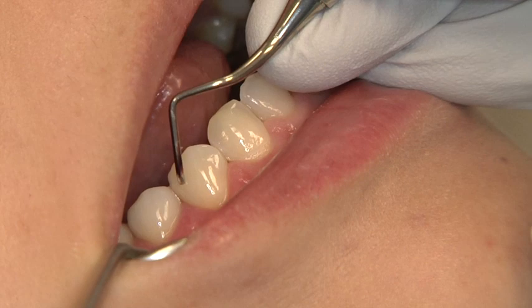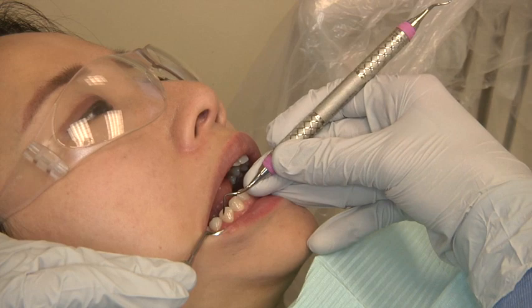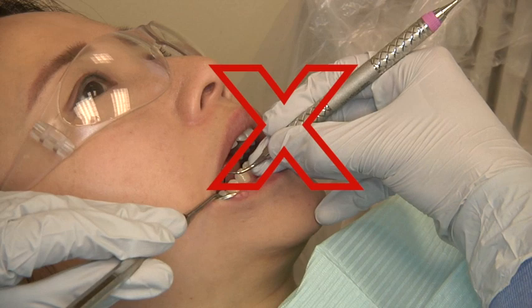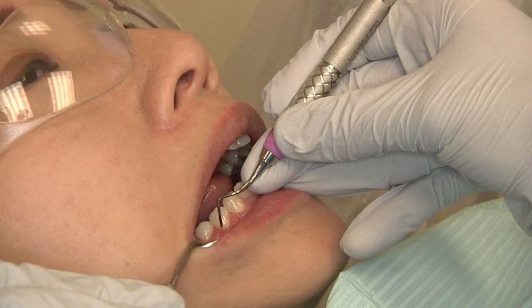This is done by applying the weight of the hand into the fulcrum while rocking the wrist and forearm as one unit. Movement of the fingers alone during instrumentation weakens the working stroke and adds stress to the fingers. Apply lateral pressure by pressing the working end against the tooth surface or calculus deposit, while applying an equal amount of pressure with the index finger and thumb in and against the instrument handle.